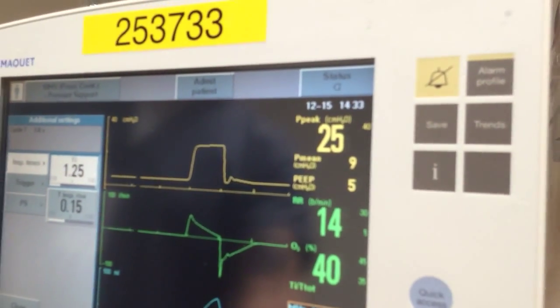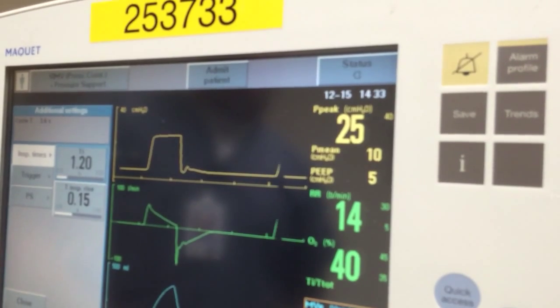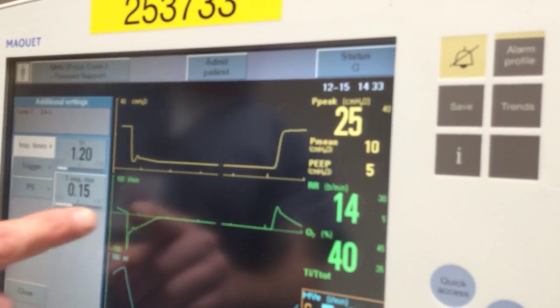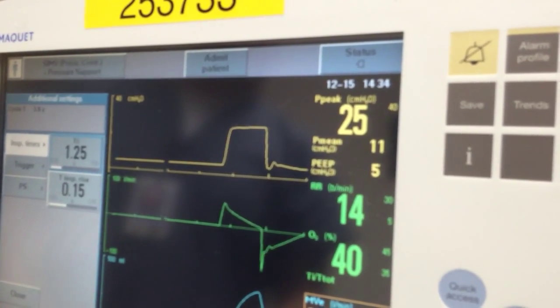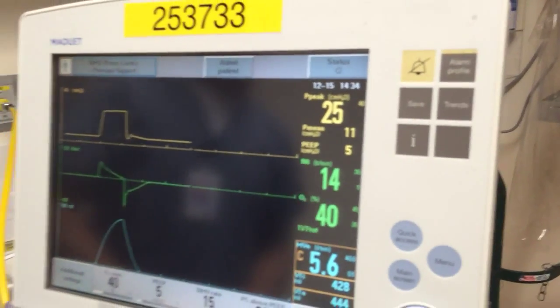So I would still go a little bit further. Maybe you go to 1.2 seconds. And I'm going to look at my waveforms. Okay, and let's say right there we get all the way to 0. You still got a smidge more, but that's really close enough to call good. Okay, so now we're at 0. So next, we're good with 0 on this patient.